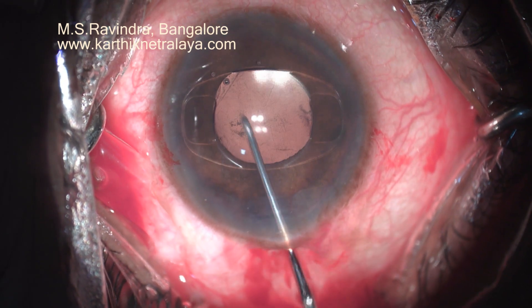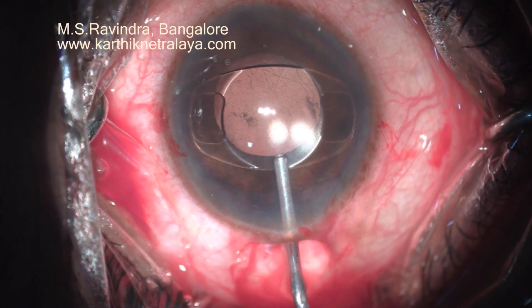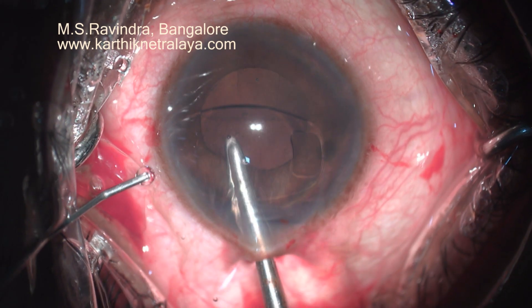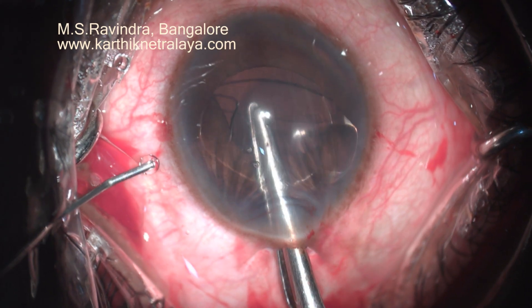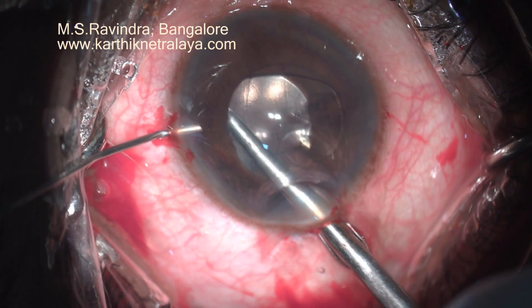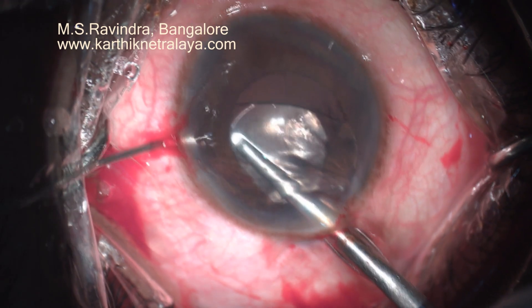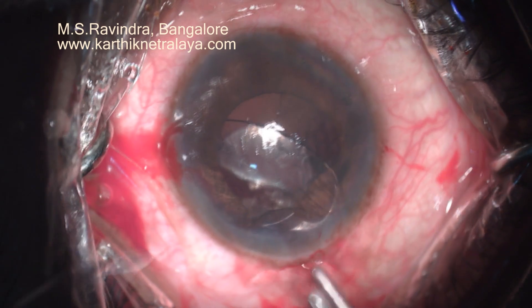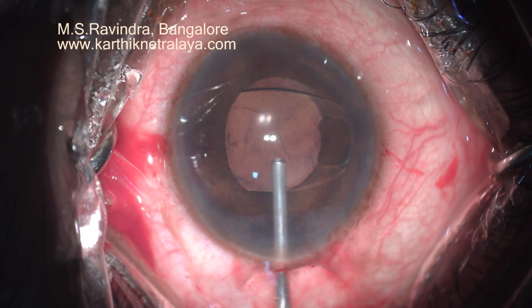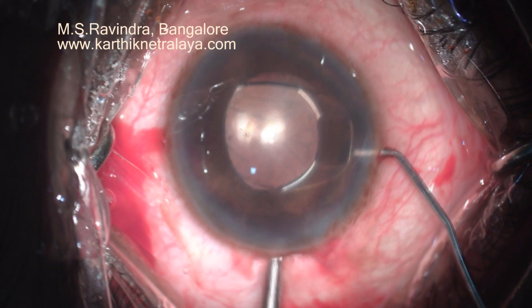There is an upthrust. Continuously, I had to keep on replenishing with viscoelastic. As you can see, the upthrust pushes the eye contents out. I could manage to enclavate one haptic. Now as the moment I put it, the lens is going to come out. So I position the cannula — which is a special 27 gauge short cannula — before I open the anterior chamber. Folding the lens, everything is okay.